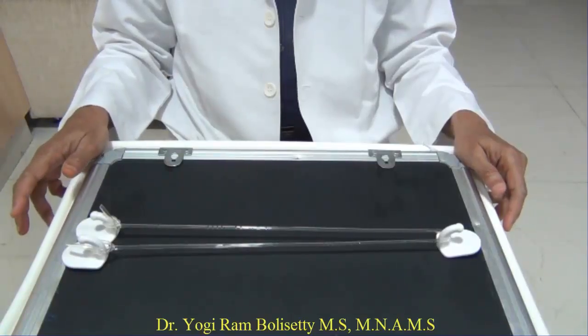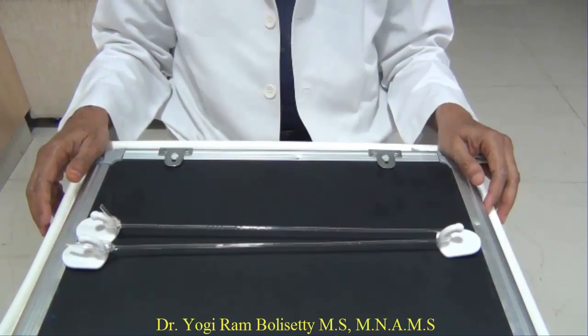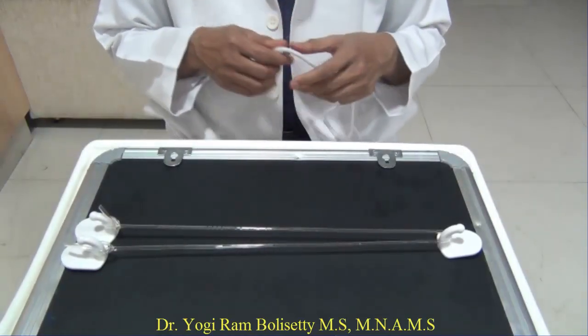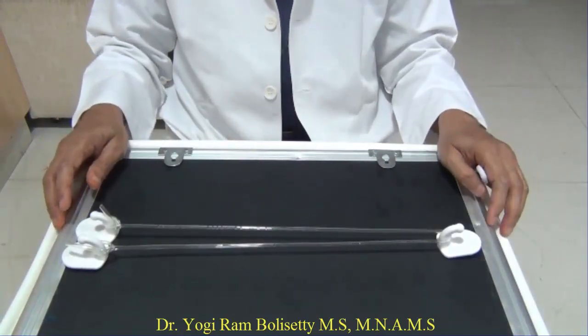Hello, I am Dr. Yogi Ram Bolisetty, and now I am going to demonstrate to you the formation of a reef knot with single hand. If a surgeon is right-handed, he should use his left hand to form the knots. So now I will demonstrate to you the method of making a knot with the left hand.